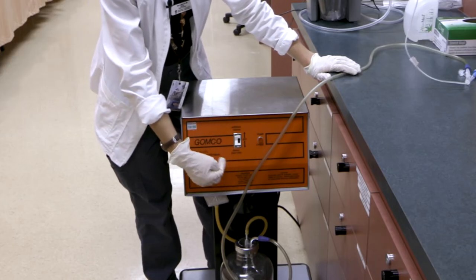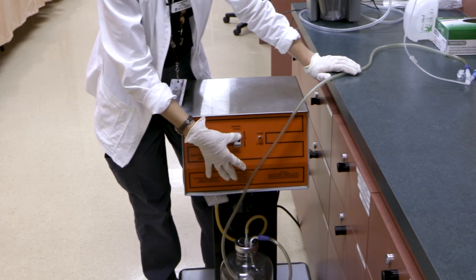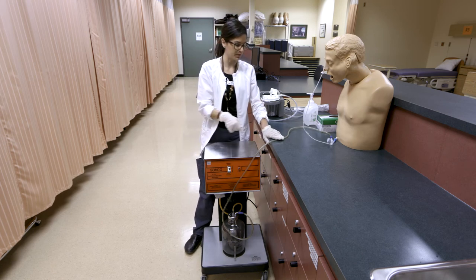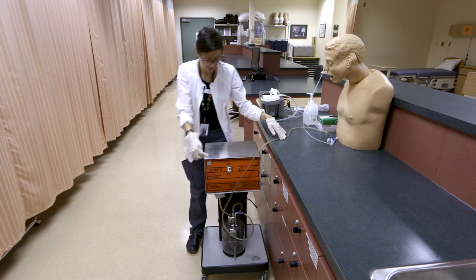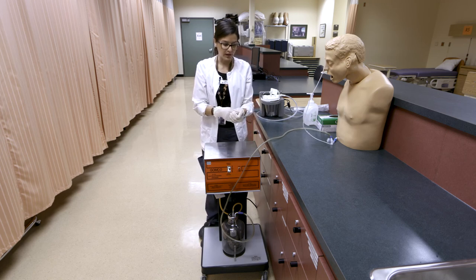We'll turn on our machine. You can see there's a lower suction setting of 90 millimeters and a higher suction setting. It isn't plugged in right now, but it will sound like a motor when on, and you will see contents come out through the tube and work their way down into the canister.